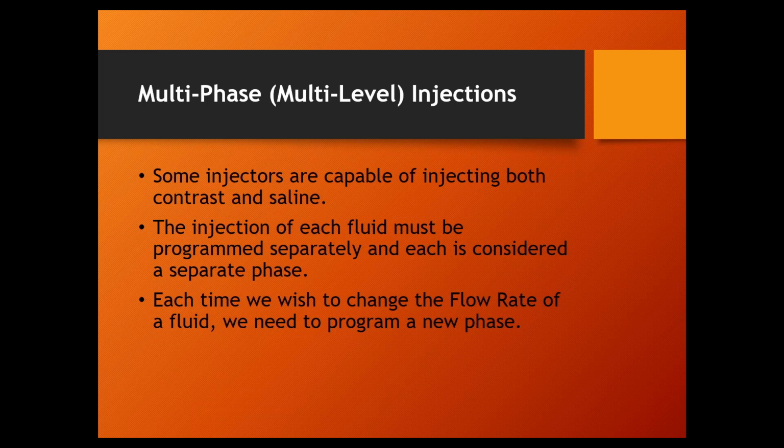And what will happen is when we hit the inject switch, jumping ahead a little bit here, I'm going to hit lock, which locks the protocol in. Then I'm going to hit the arm button. Now, when I hit arm, this is where I mentioned this earlier. As soon as you hit arm, and this is universally true of pretty much all contrast injectors, there's 1 or 2 weird ones that don't do this, but for the most part, as soon as you arm it, we're ready to fire.